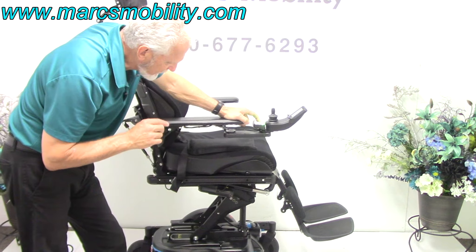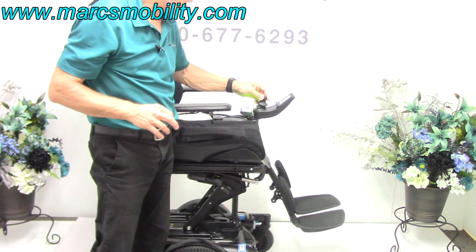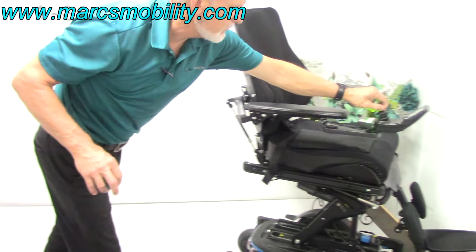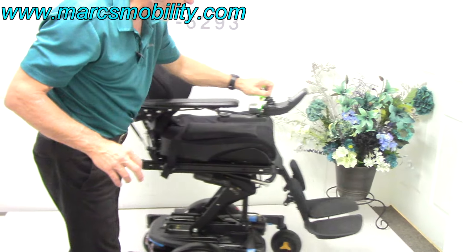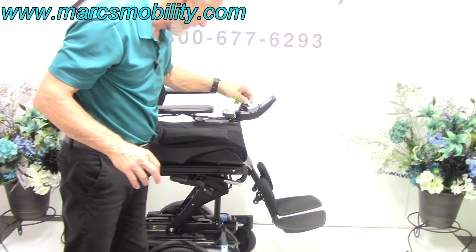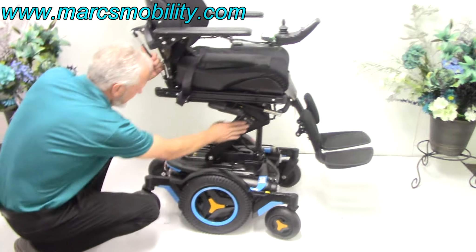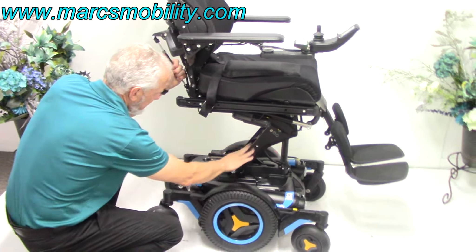You can drive this chair with the seat elevated, but it'll be at a reduced speed. As you can see, it still drives pretty fast, but the speed is reduced so you can still move around. The seat is elevated and we can see the armature for the seat lift — you can see how solid this is built.